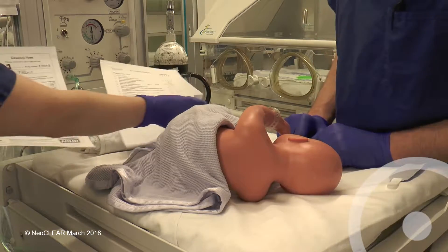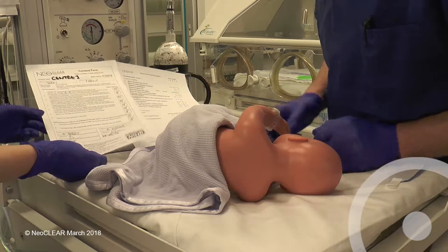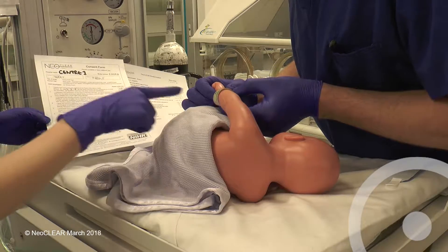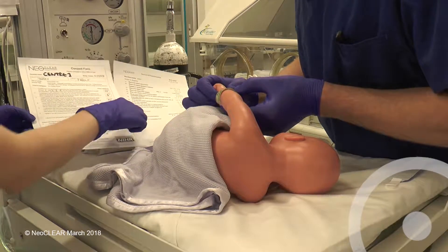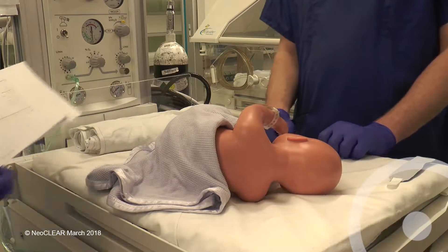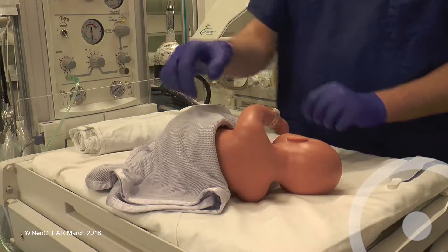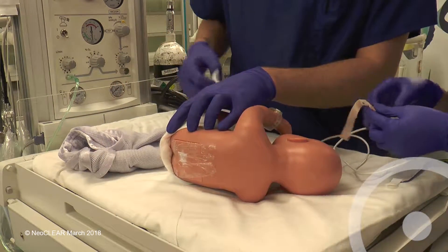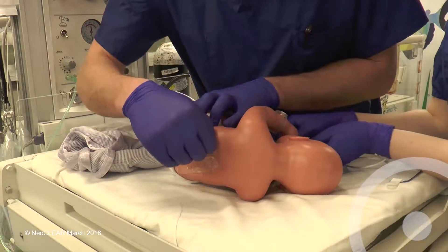Before starting, check the consent form and bring the printed allocation from randomisation. Confirm identity and allocated technique with the assistant. Assistants should wear non-sterile gloves. The area should be warm and well lit. Term babies should have had local anaesthetic cream applied; remove this and clean any soiled skin with water.